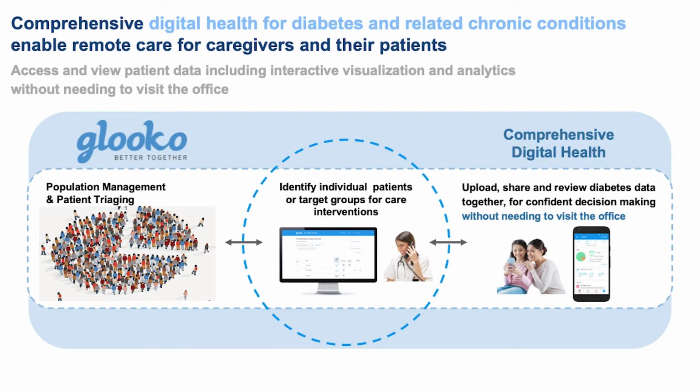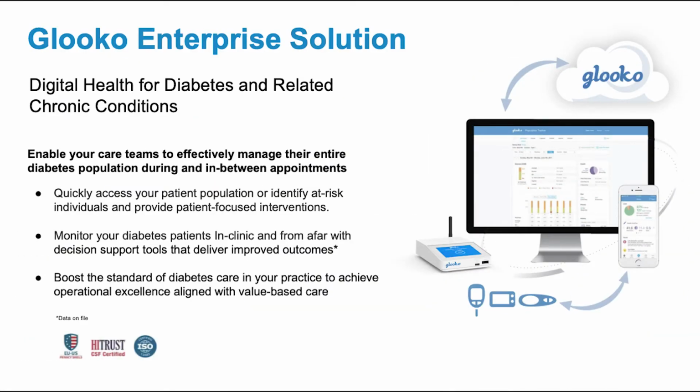Glooko Enterprise also meets providers and care teams at their level of familiarity of analysis and interpretation of the data, so that they ultimately remain focused on patient therapy, spending less time figuring out devices or transitioning reporting systems, and more time with the patient towards improving care. The overall end result is improved outcomes, patient and clinical satisfaction, along with an efficient workflow for population health management.